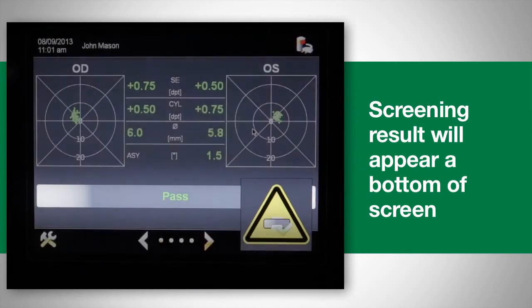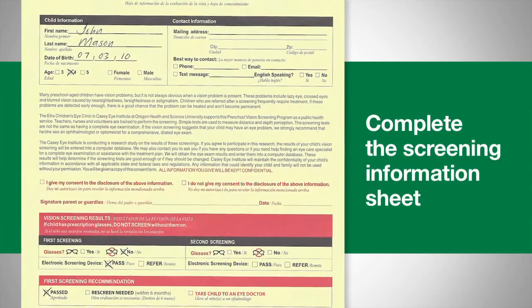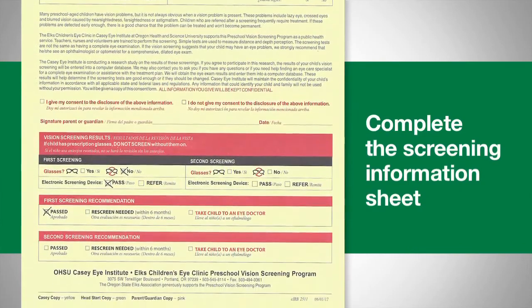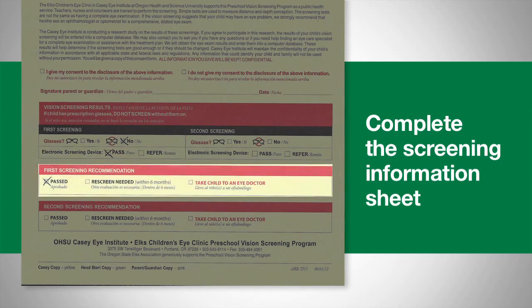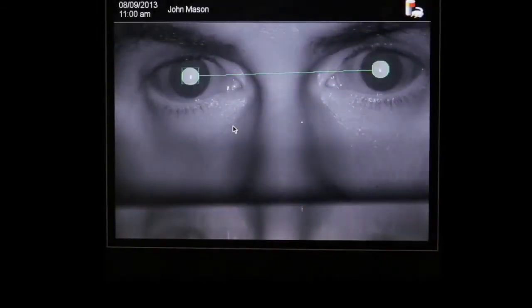The screening result will appear at the bottom of the screen and is automatically saved to the SD card. Next, complete the screening information sheet, making sure you mark the electronic screening results at the bottom of the form with either a pass or refer. Remember to complete the recommendation: pass, re-screen needed, or take child to eye doctor.